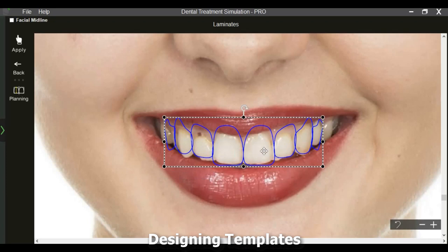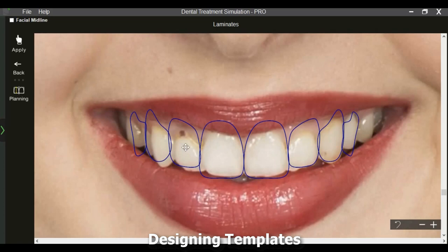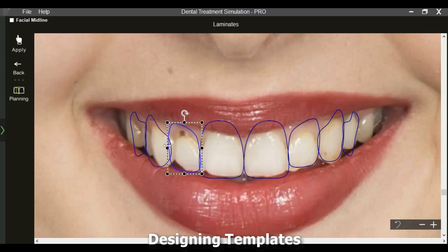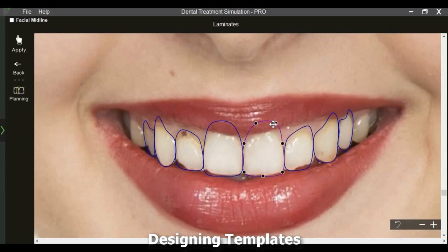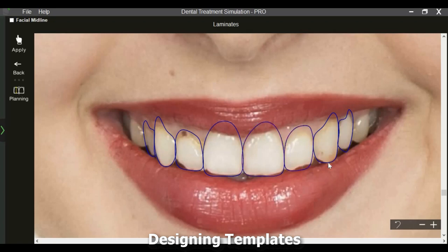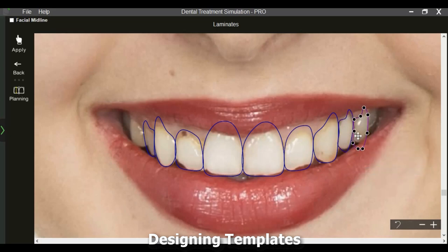Size, position, and alignment of all the templates can be adjusted as a group. In addition, individual templates can be resized, rotated, or designed as needed. Additional templates can be inserted by duplicating or mirroring.